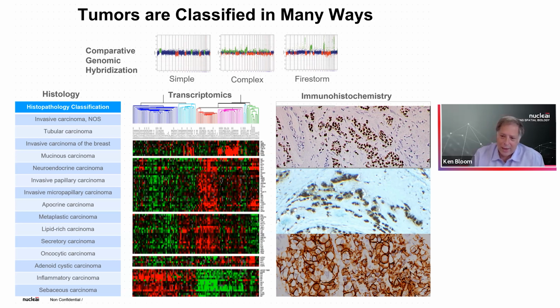And that was great, except we recognized that that ground up piece of tissue contained benign elements, in situ elements, and invasive elements. And we really only cared about the expression in the invasive elements. So immunohistochemistry allowed us to do that. We could apply specific antibodies to estrogen receptor, progesterone receptor, and then more importantly, in the 90s, early 2000s, HER2 new protein became very important as well.